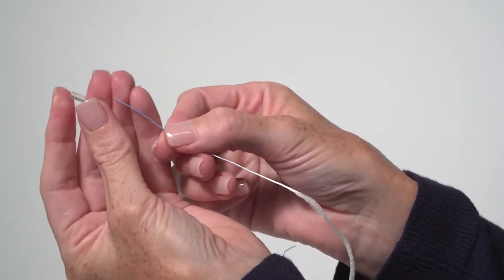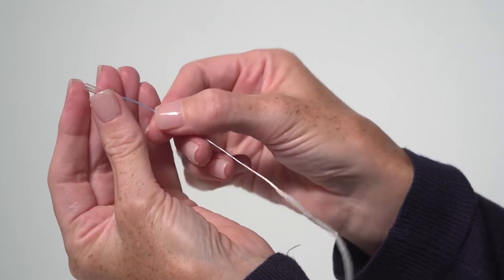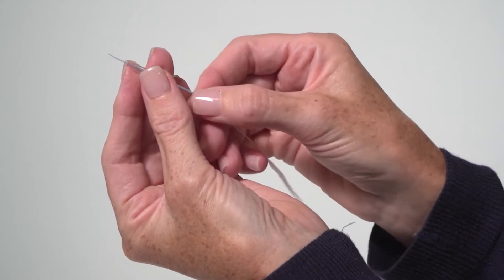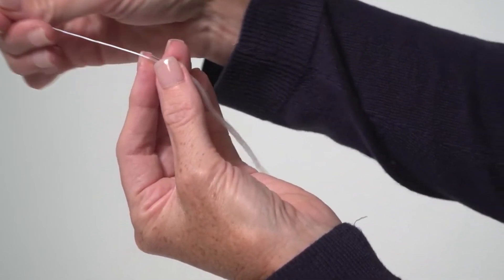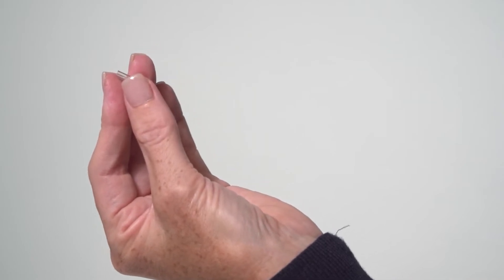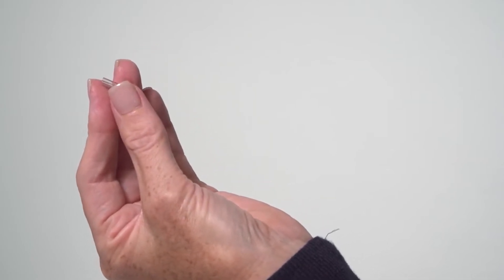Insert the blue end of the floss from back to front through one of the probe channels. Pull the floss along its entire length through the channel. Always enter the probe tube from the rear to avoid accumulation of debris inside the vents. Proceed in the same way with all probe channels.